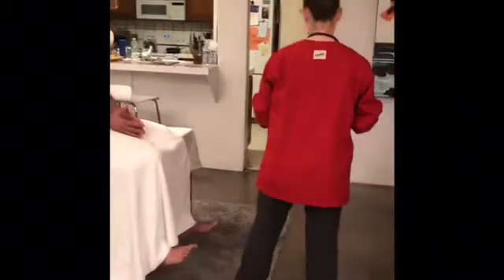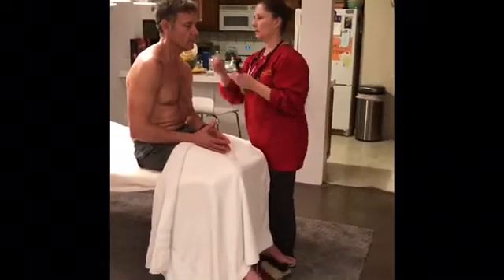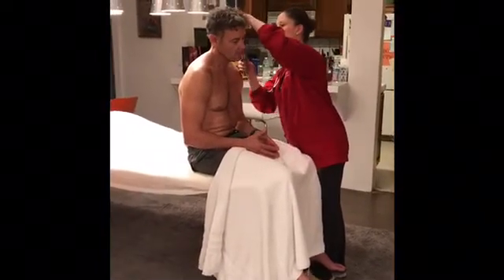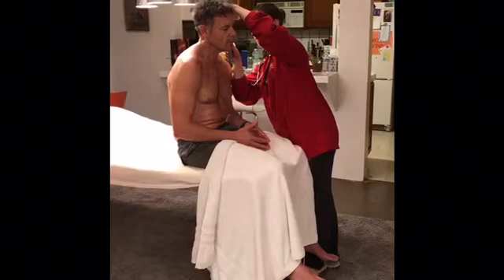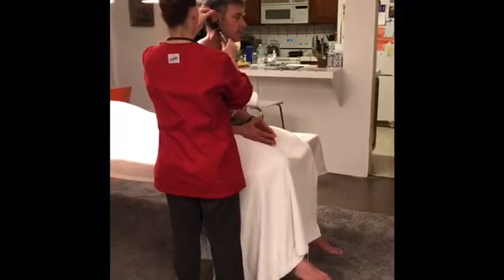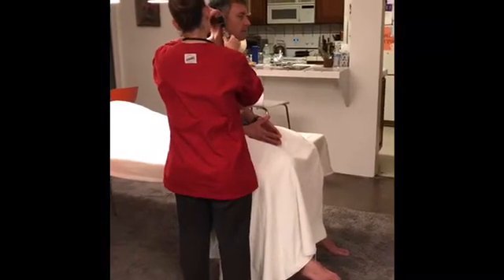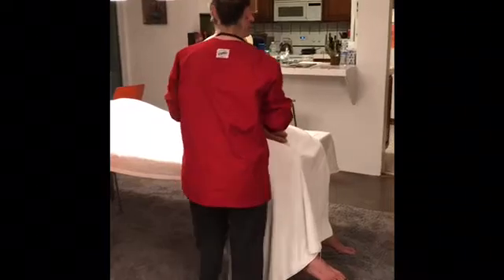Now the inside of the ears. I'm going to go ahead and pull the ear up and back. Just turn it a little this way. Pull the ear up and back. Very gently, I go ahead and look in over the tympanic membrane, making sure it's curvy, and maybe visualize any of the small bones. Same thing on this side. Tympanic membrane looks white. Don't see any extra wax or fluid, which is perfect.